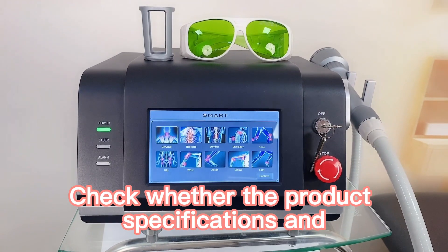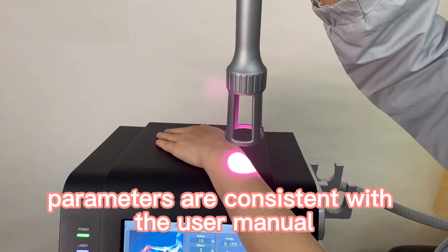Check whether the product specification and parameters are consistent with the use manual.